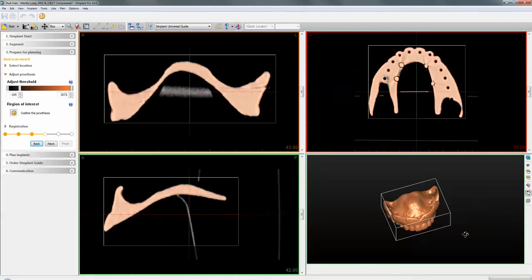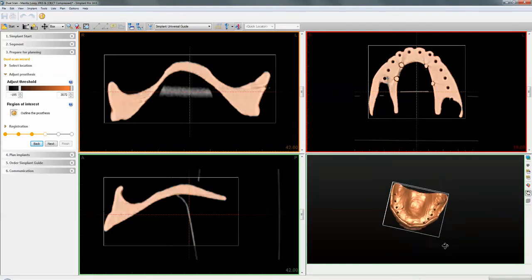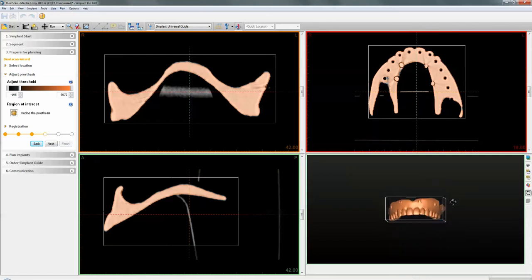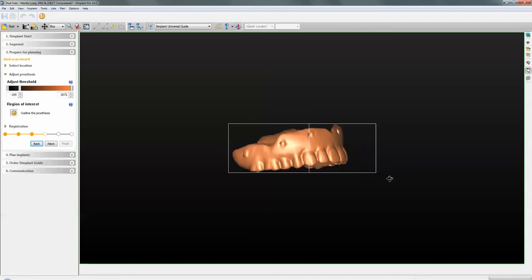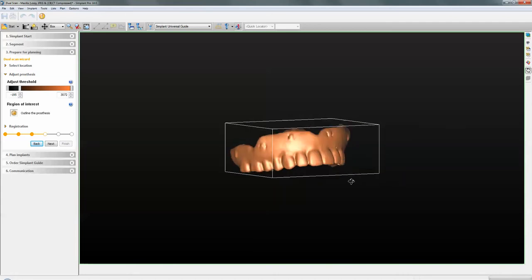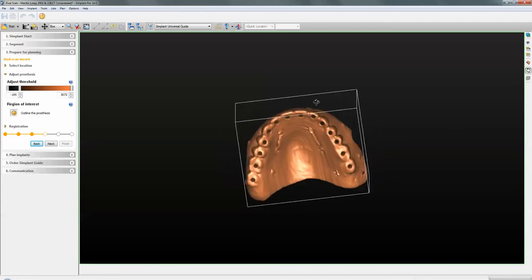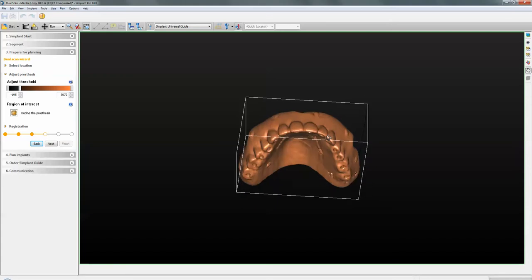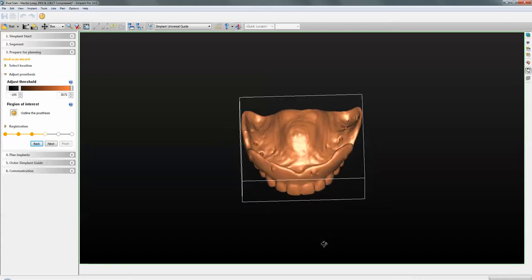It's showing you that this is the denture, and you can see in the image how the beads were placed. Please do not use too few beads — there will not be enough reference points to merge the files together.